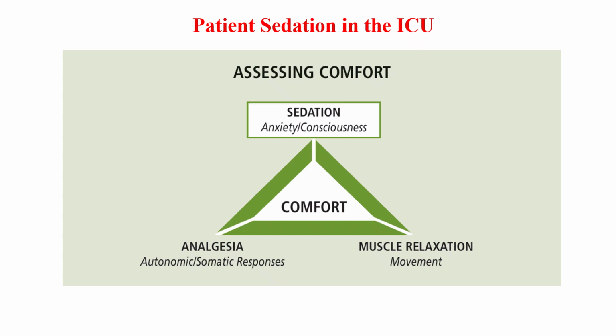Appropriate sedation improves comfort, reduces anxiety and prevents agitation while avoiding excessive sedation that can lead to complications. Addressing the challenge of sedation in the ICU requires a careful balance to avoid both over sedation and under sedation, as each carries significant risk and impacts patient outcome, ICU resources, and cost.